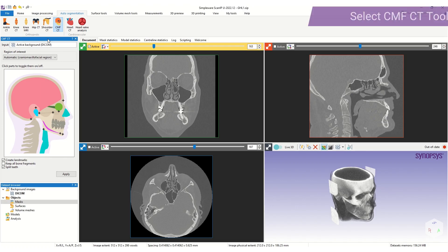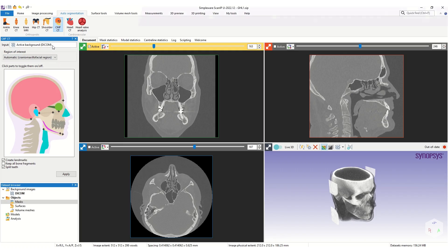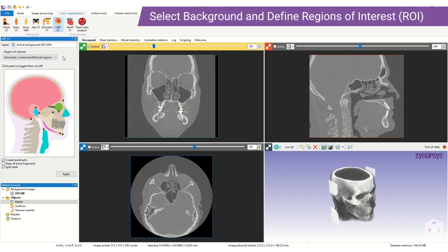To use the tool we select the CMF icon. This brings up the tool in the active tool window. We select the background we are using as the input, and we can also define the region of interest, which is useful when the CT scan data contains a region larger than the CMF region of interest. The inference speed of the tool is influenced by the volume contained within the ROI. In most cases we recommend the automatic selection.